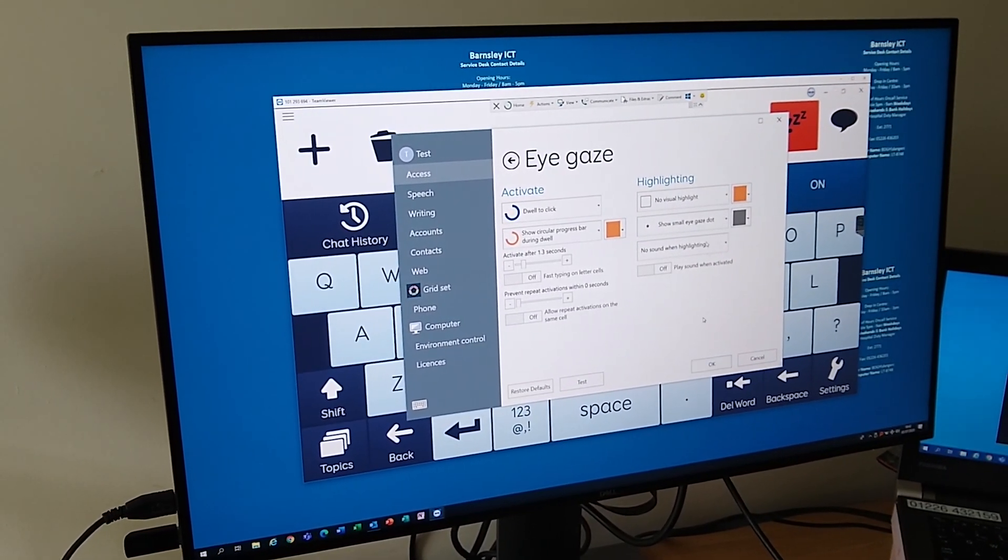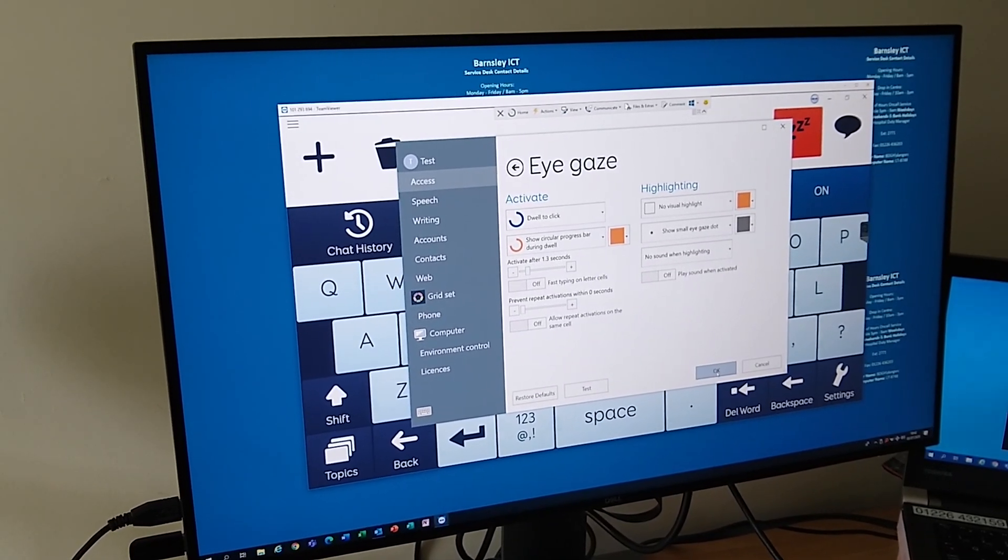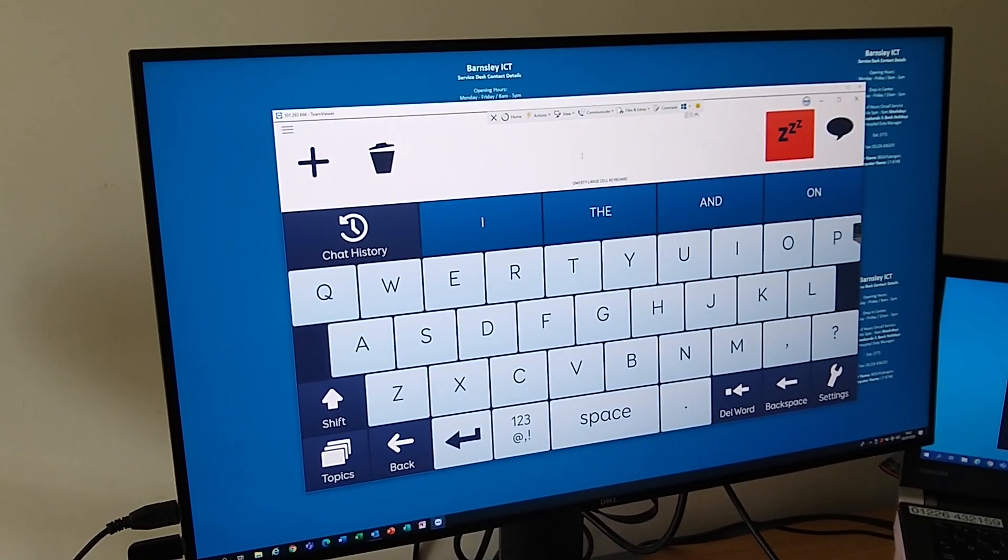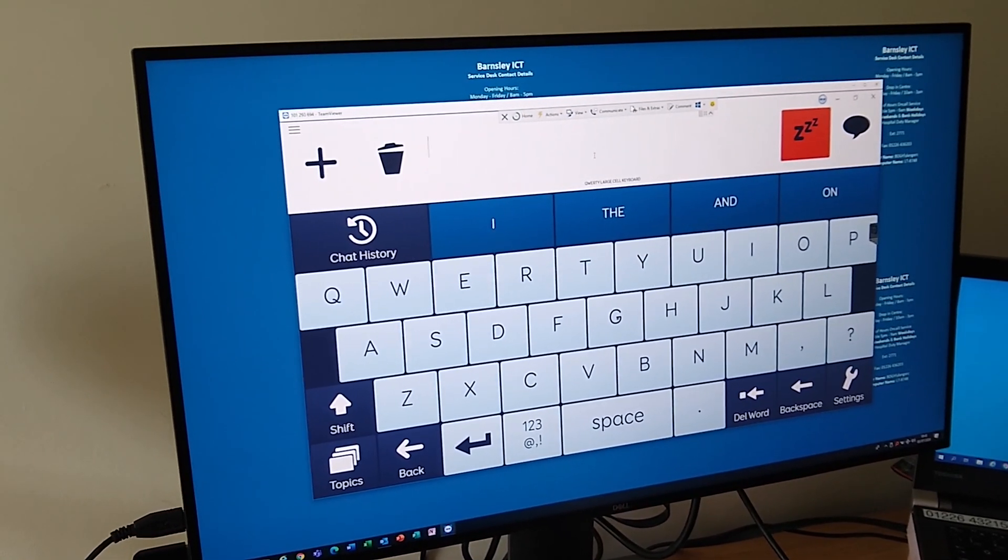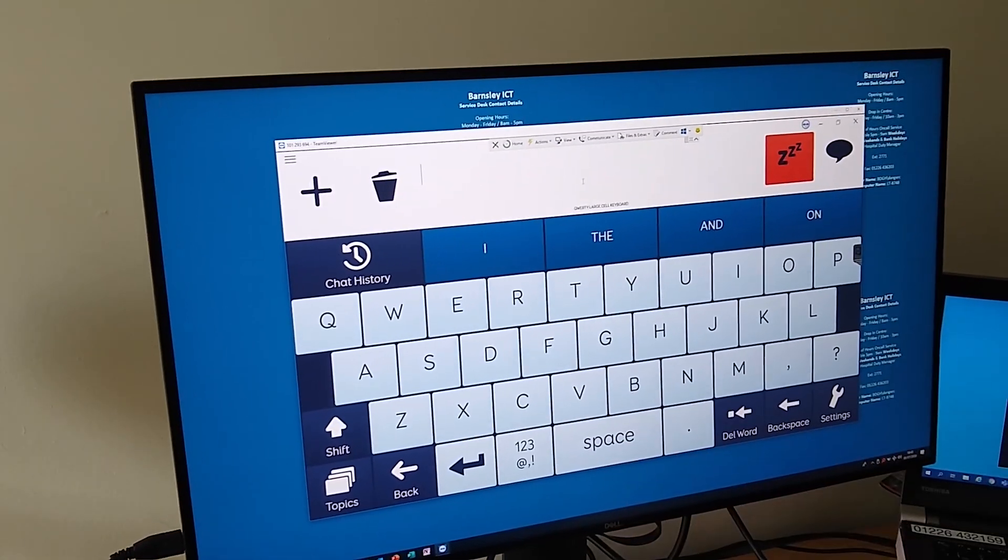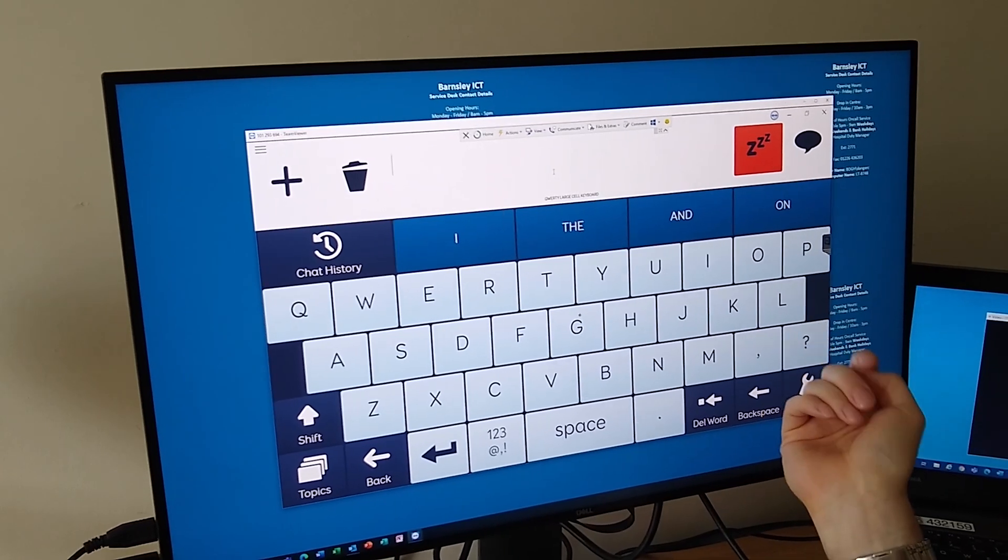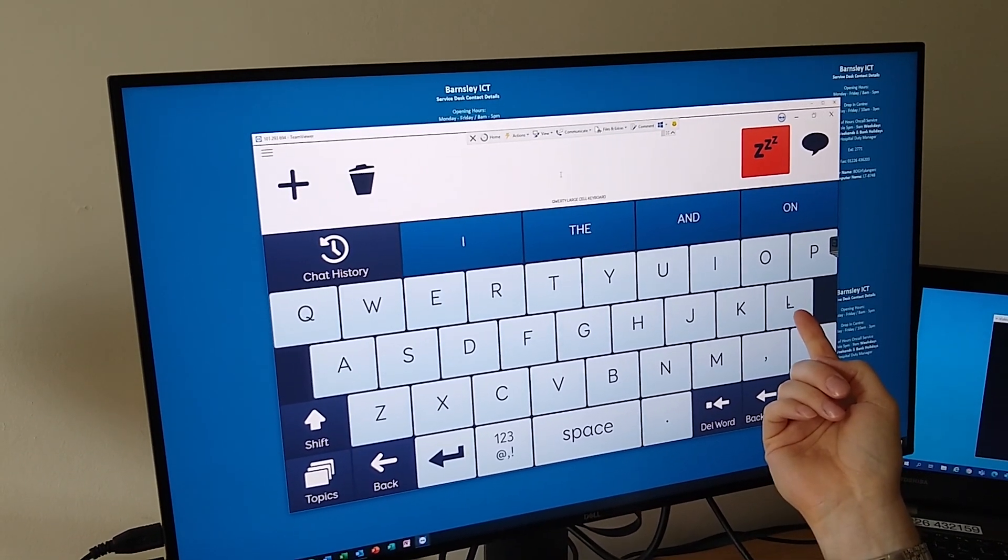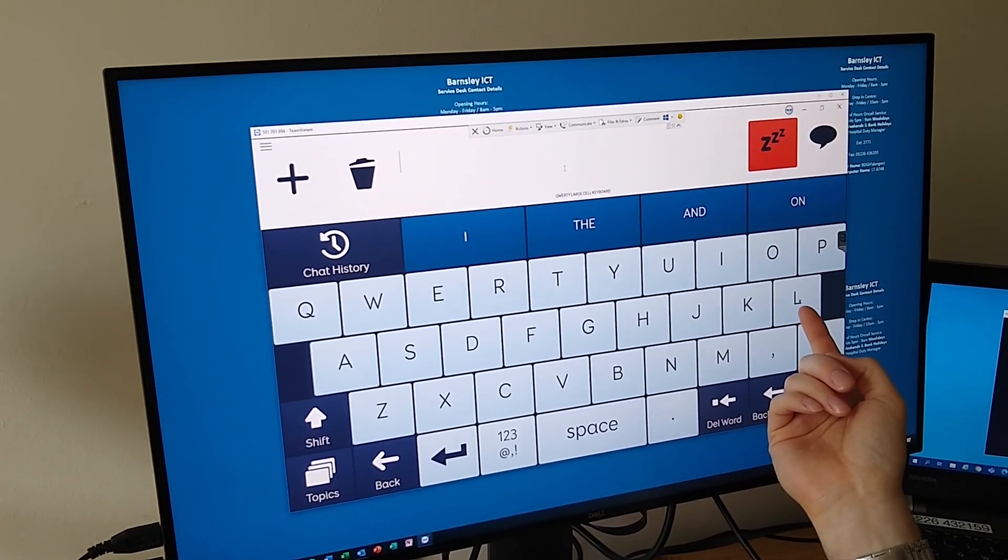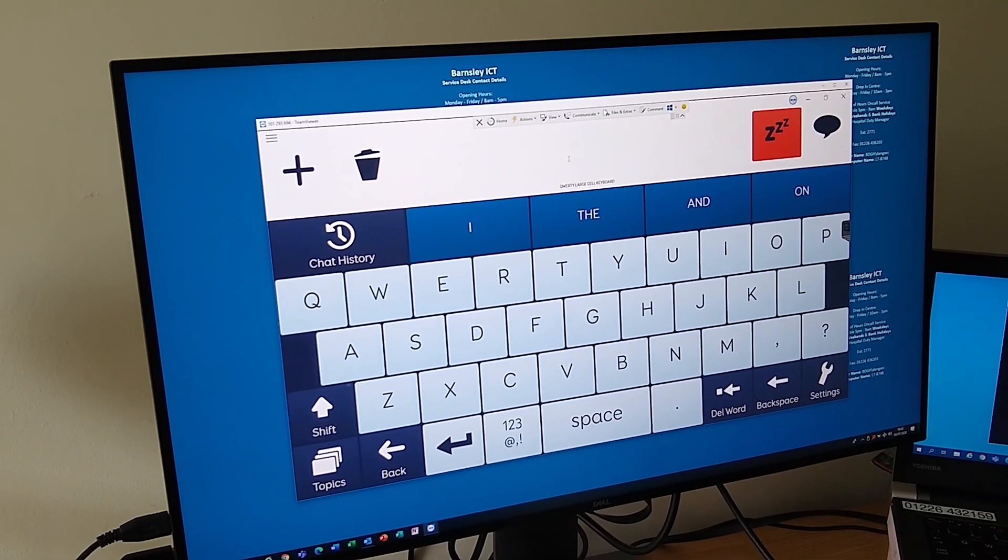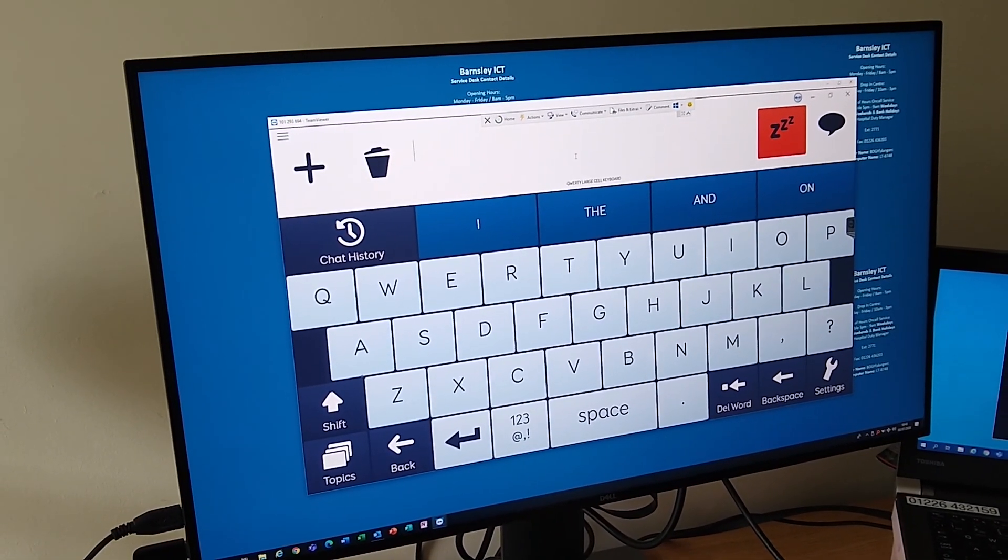I want you to start by looking at the G in the middle of the screen. Hold your gaze there—that's really nice and accurate. That little gray dot's exactly where we want it to be. Now I want you to have a look at the L on the other side. That's nice. As long as it's inside the larger light blue square, that's fine. Have a look at the A on the other side, so have a look right in the middle of the A letter.